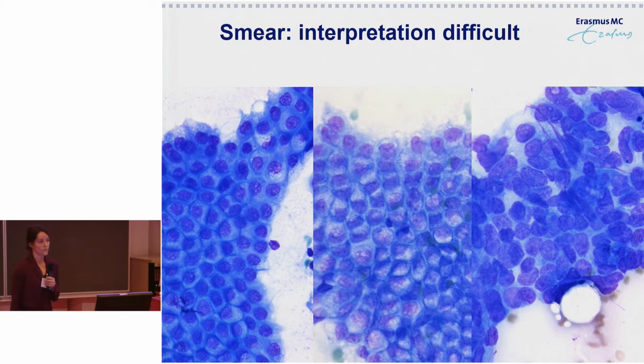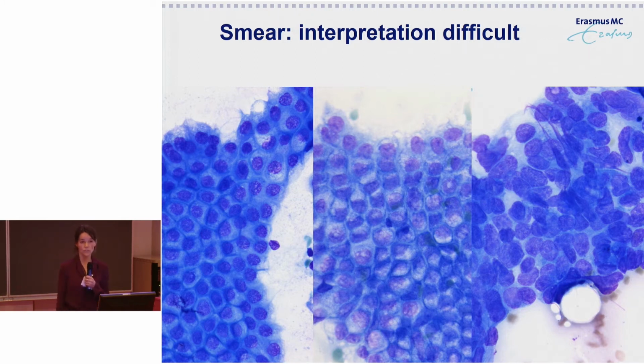But then, when it comes to reality, we have all kinds of material, and this is well preserved material. So let's try to categorize that. What would you say about this sample? Yeah, experience. Really, yeah. That's not easy. This sample is showing cells with overlapping nuclei, right? And this is not the typical normal appearance. This is cancer, okay. But what to do with this?